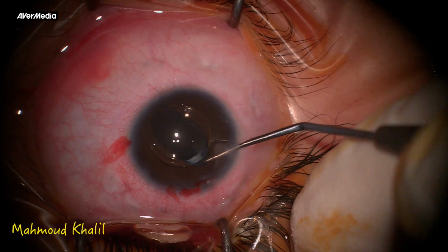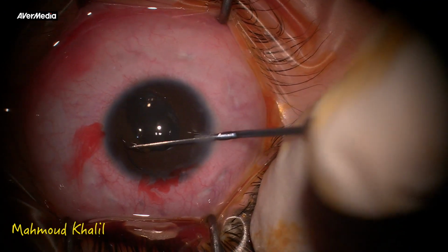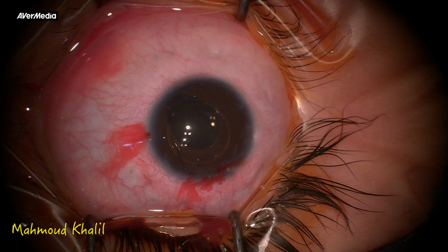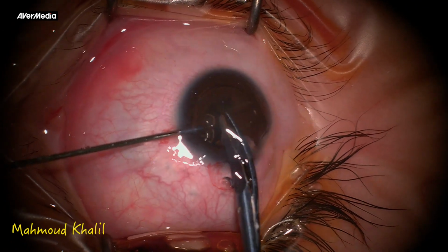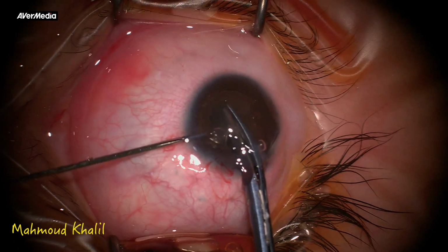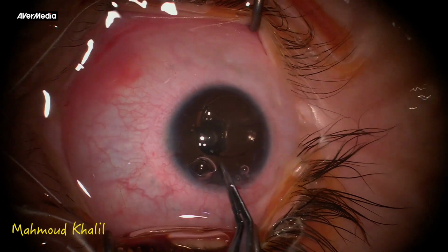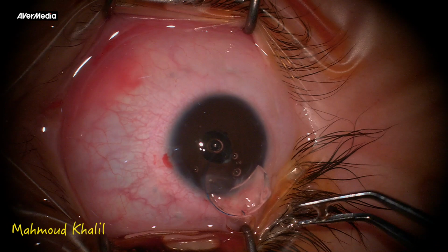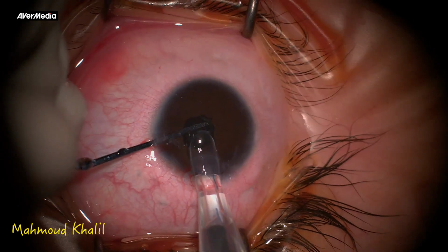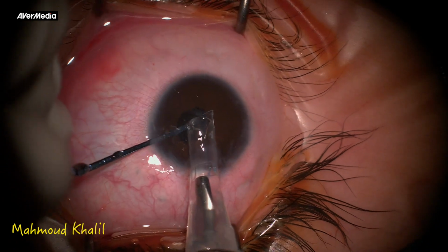The previously implanted IOL was a 3-piece IOL in the sulcus, so dialing the IOL at first inside the AC and then going with a forceps and a scissor to cut the IOL. This helps not to enlarge the wound, keeping the wound without stitches. After the cut, catching the IOL and removing it from this small wound.